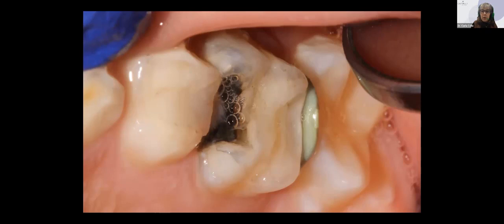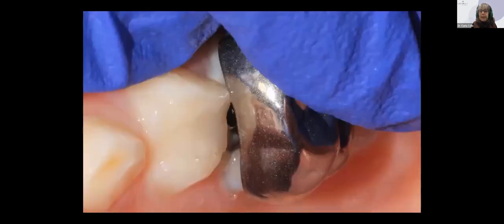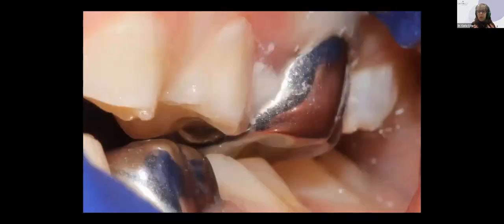For a week or two, we fit the crown and literally cement that crown over top of everything after removal of the separator. Obviously, or maybe not so obviously, remove the separator and place it over top. The crown is high, of course; we haven't done any preparation. This child's going to leave the practice within 1 to 2 weeks. That child will intrude that tooth with his occlusion.